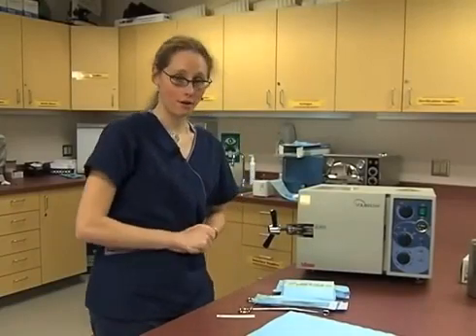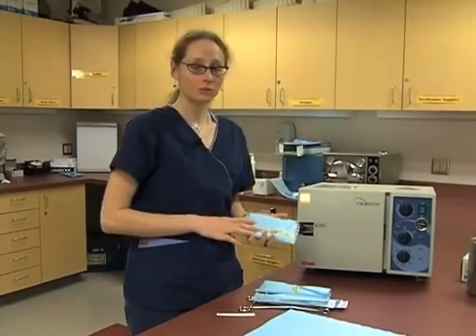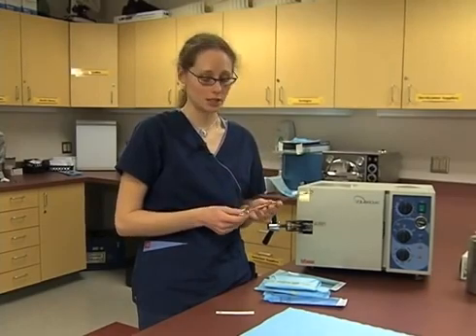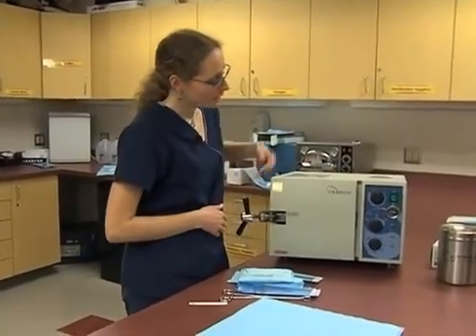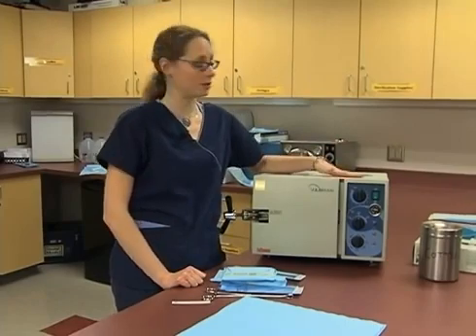Now, when we're going to load our autoclave, now that we have all of our tools ready, we'll probably have a variety of tools: things that are wrapped, things in pouches, and items that don't need to be wrapped or put into a pouch. Some objects are used for non-sterile procedures but need to be very well cleaned. So they will be sanitized and dried, and then they'll be put in the autoclave to be fully cleaned. And then we will store them in a clean drawer until they're used. A lot of autoclaves are very different, so whenever you get working in an office, you'll want to get out the autoclave manual and get familiar with the autoclave that you have.